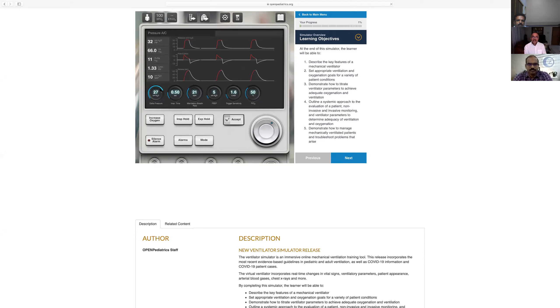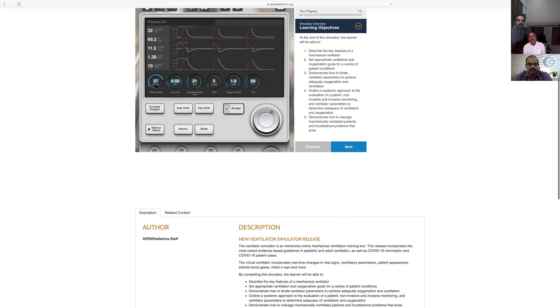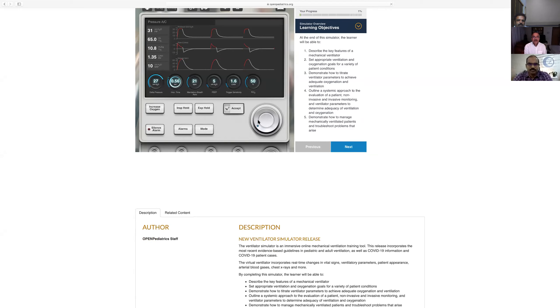The pressure level you allow the ventilator to work determines the tidal volumes. In pressure modes, by altering the pressure limit you alter the tidal volume. If at 20 cm you get 400 ml and want 500 ml, you go from 20 to 27 cm and the volume will increase. The normal inspiratory time is around 0.8 to 1 second. Look at the PEEP setting here — PEEP setting is low.